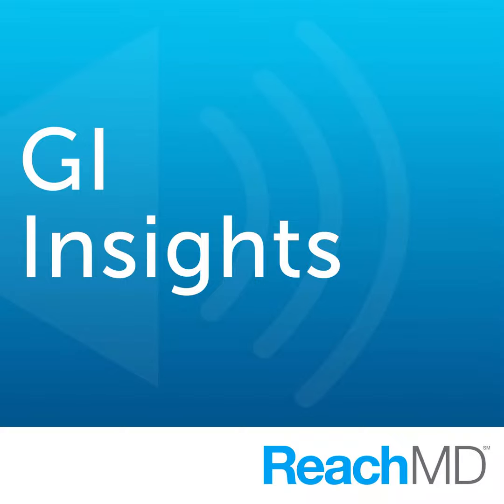Tom, there's a lot of other technologies that I've seen, and in fact, some that are being used now, such as narrow-banded imaging. I've done some chromoendoscopy where I'm sitting there with a spray catheter, spraying a dye on tissue, trying to see if it changes colors or perhaps has some other change. And I've heard about autofluorescence, which basically is having kind of an optical filter on the scope to try to pick up abnormal tissue. Would you consider these technologies competing technologies or very different than what we're talking about here with the microscopic examination?